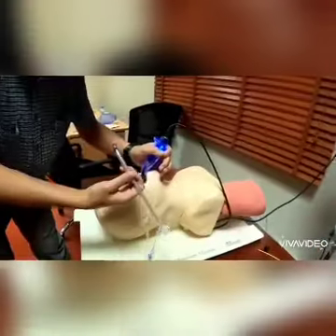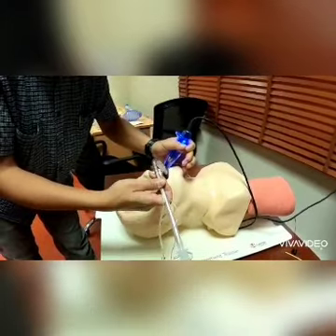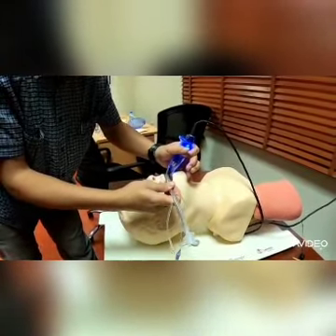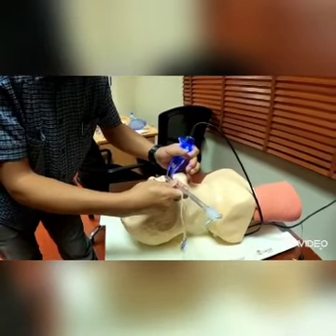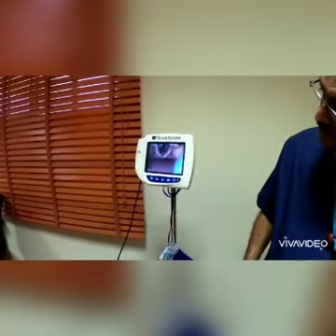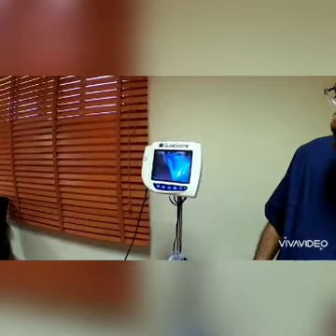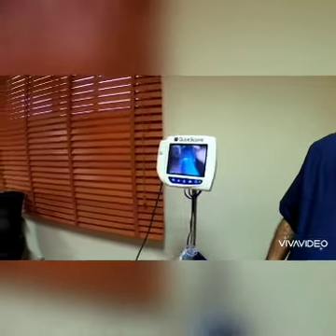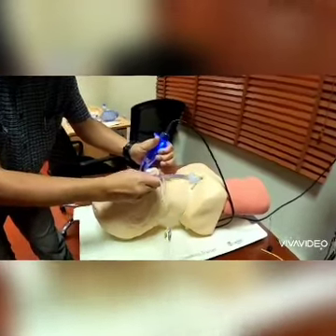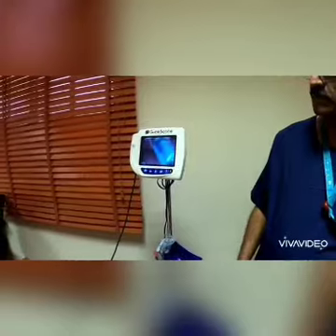If you look at the mouth, I want to avoid the teeth, as I said before, not to rupture the cuff, but I'm entering the mouth with the ET tube at 90 degrees angle to the face. So once I'm in, gently I slowly turn. As I start seeing my ET tube there, I will turn it forward, and then I will move my ET tube in. If you look at this movement now, I'm turning in, and as I'm looking at the screen, then I'm in.